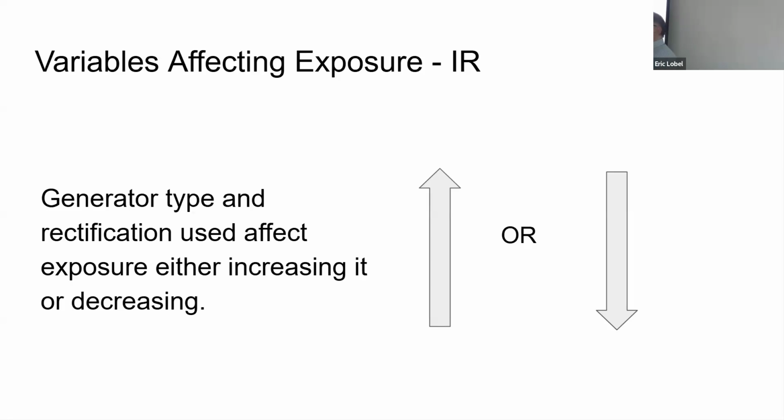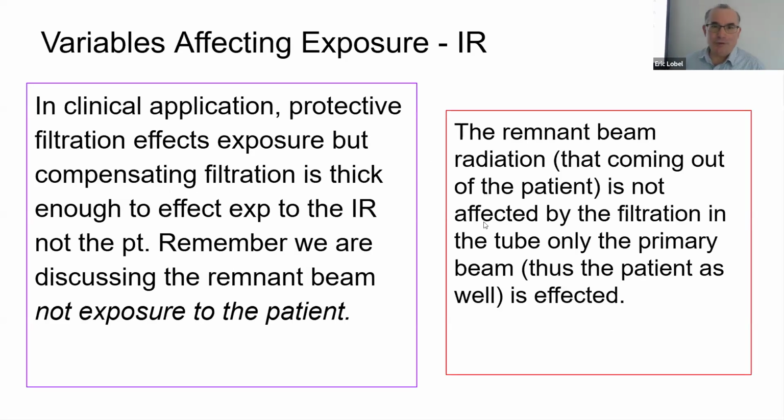If that happens consistently, it's going to happen, you know, when it happens automatically, and that's legit. But if it's happening all the time, right? Or here's what's not supposed to happen. If you have presets that work, you shouldn't have to change the kV every time you do something. If you see that the technologist is changing the kV by 5 or more kV, then what's the use of the kV preset that pops up to begin with? Right, so I don't quite know how we got on that tangent, but important to know.